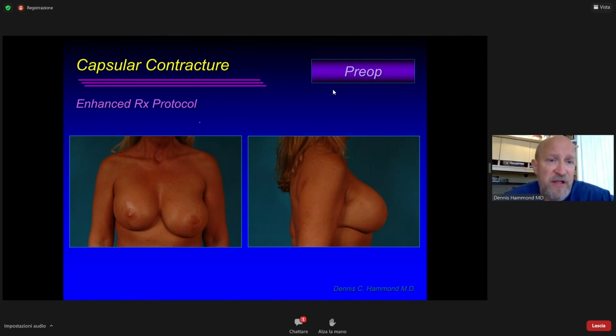And here's the question: do you use polyurethane implants for recurrent capsular contracture? We don't have polyurethane available to us here in the United States. I remember back in the day we did, back in the early 90s, and people were very adamant that they felt polyurethane was helpful. And as you know, there are many European surgeons that also feel that polyurethane is very helpful. The unknown here is that polyurethane has also been affiliated with the ALCL issue. But that is very controversial.